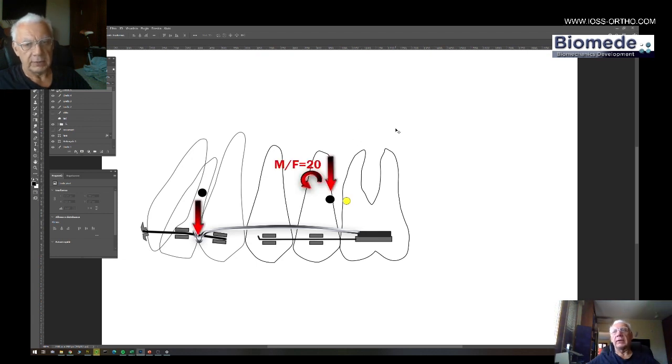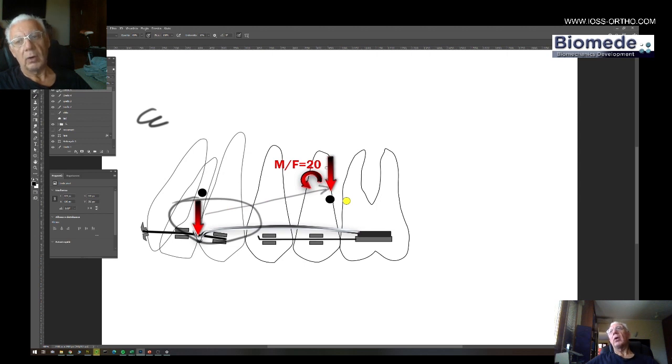You can imagine that we have this force system. The force that you see here has to be considered not the force that we apply to the anterior unit, but the activation force of the cantilever. And we start from this force because this is just the equivalent force system of what we have at the center of resistance of the reactive unit. So this is our reactive unit.